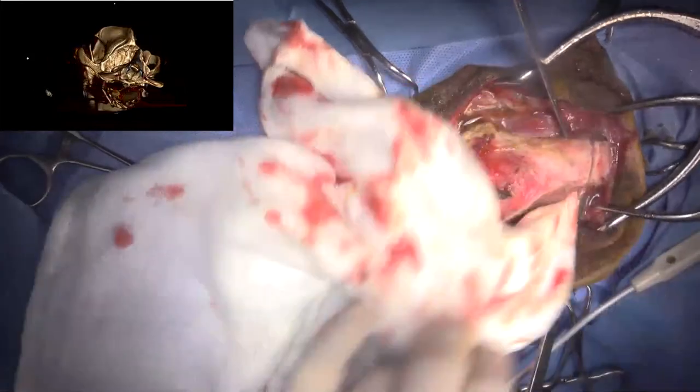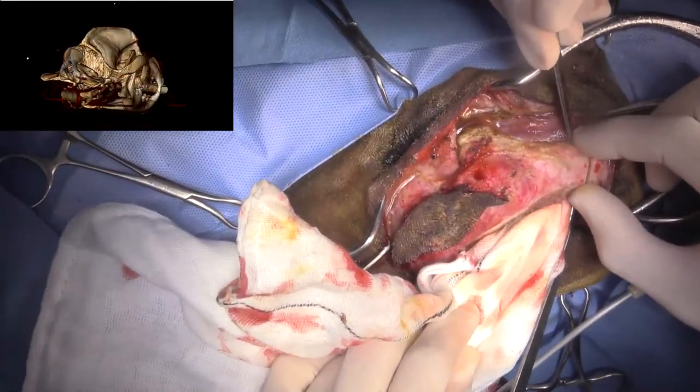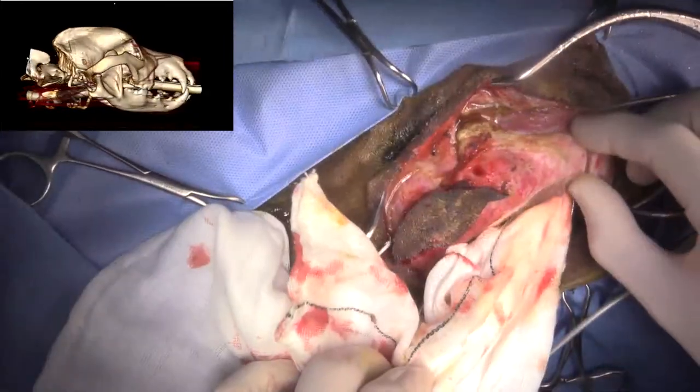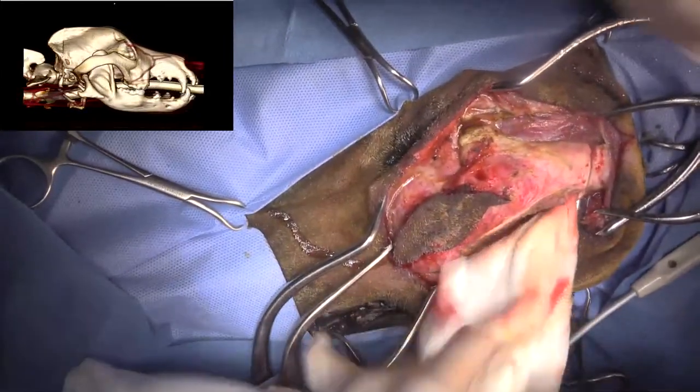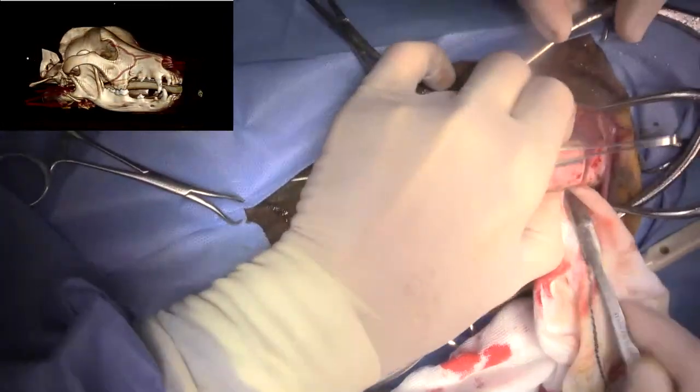Okay, so that's through there. We'll find a lot of times that when you've got a tumor, the integrity of the bone is compromised, and so it can become quite wobbly. So just leave that in here.